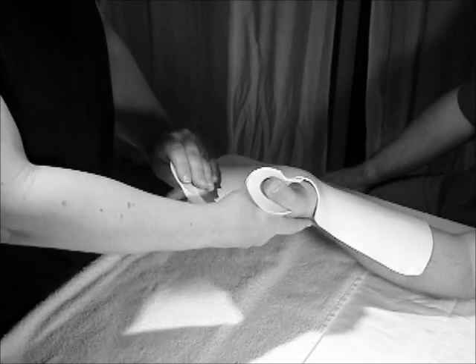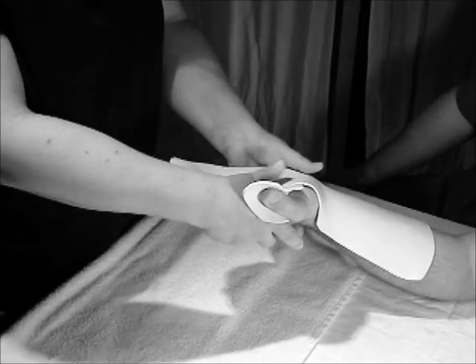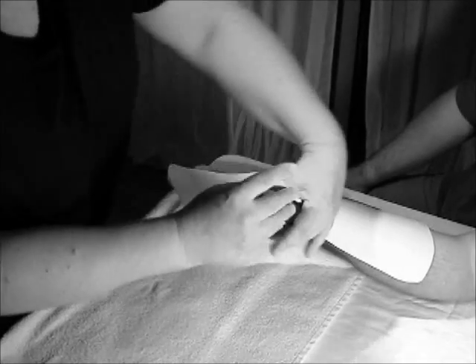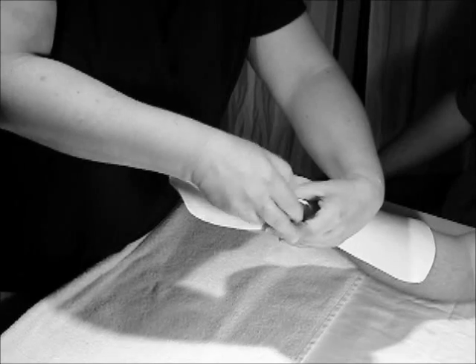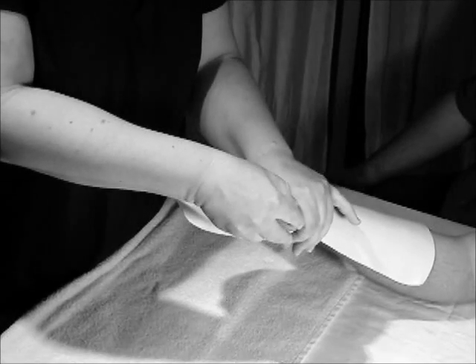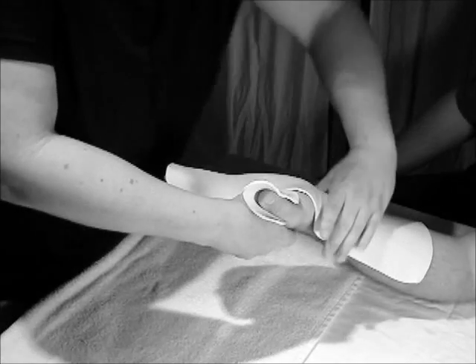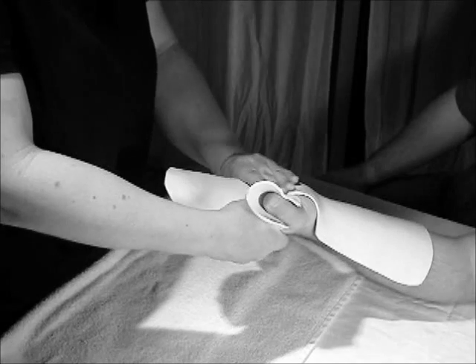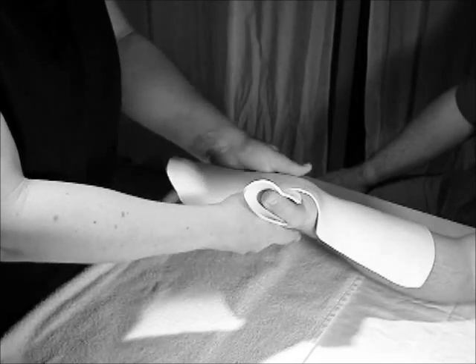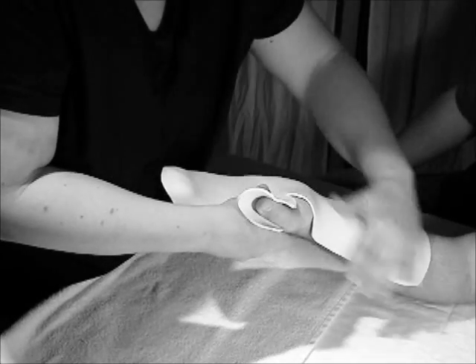So back to the bulky, you would have the bulky on, then you put the stockinette on top of that, and then when you take the splint off, go ahead and cut the stockinette off with the bulky so that you don't take the doctor's dressing off. How's that feel? Good. Good, okay. This is Tailor Splint, and it took about 30 seconds to heat up.